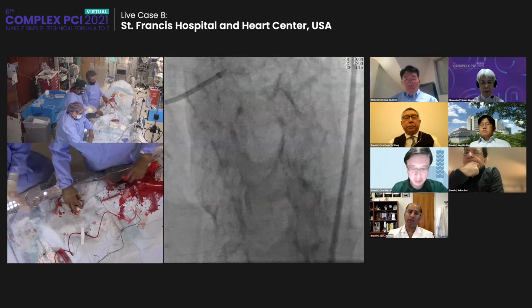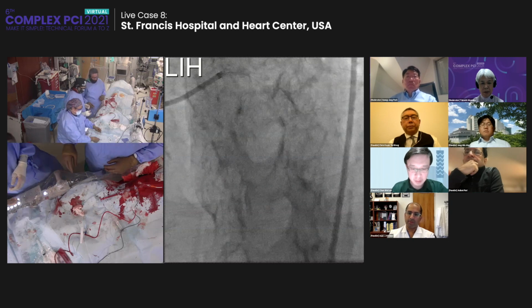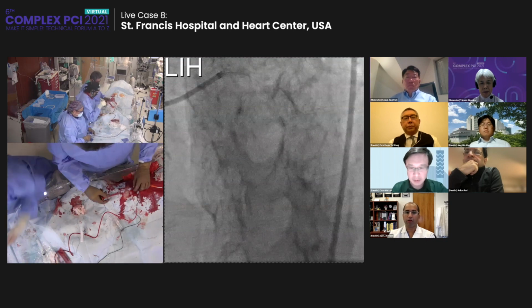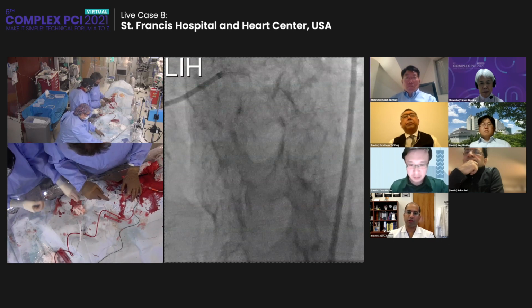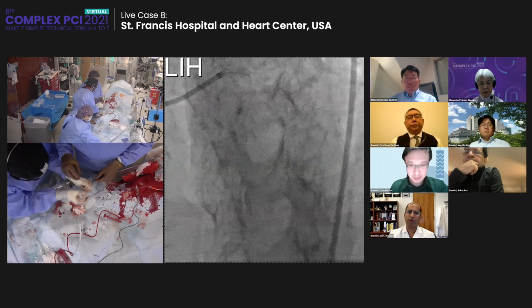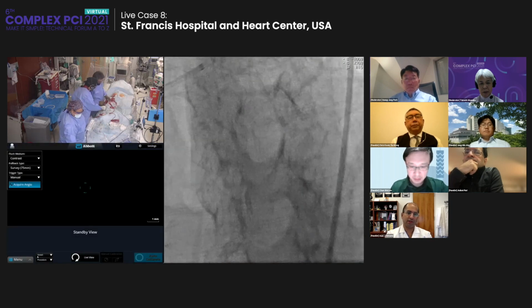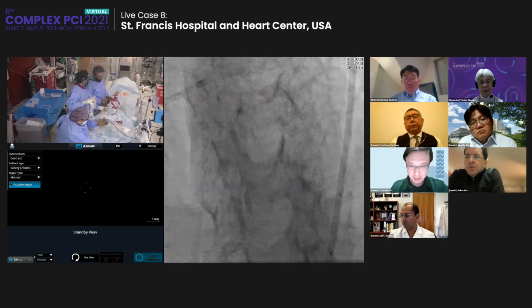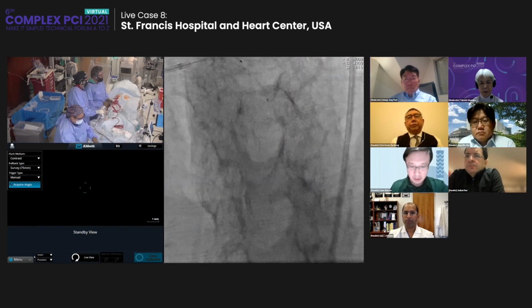Yeah, and I think the point you made about the additional benefit of the 6 atmospheres is really important, because the only circumstance I could envision that might change is if you were undersized with your balloon to start off with, because for instance, you did an image, and then the vessel yields, and you're no longer opposed, so you're not delivering energy. But if you've done the OCT up front, you know the vessel size, you know you're going to be 1-to-1, then the difference between 4 and 6 atmospheres, as Z said, is only 2 atmospheres overall, which is de minimis compared to what you're delivering with the therapy. And in the study, Ajay, they actually had us go up to 6 after we delivered the shock. So it wasn't really changing anything.